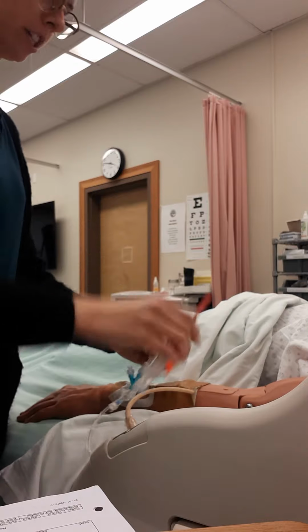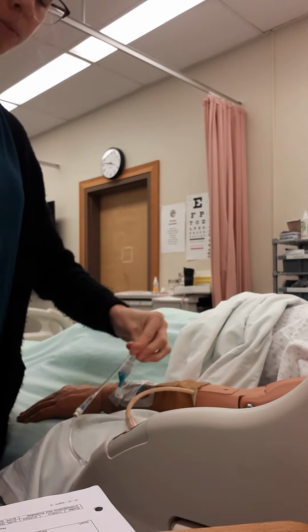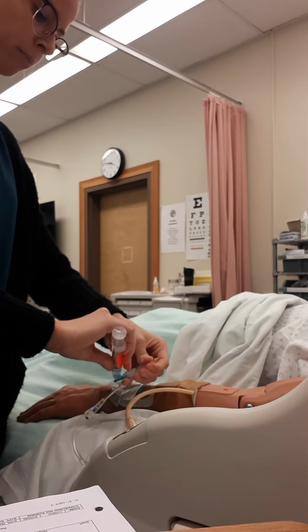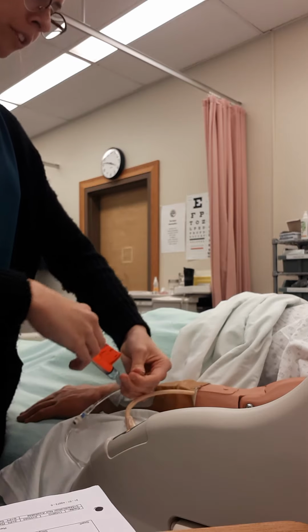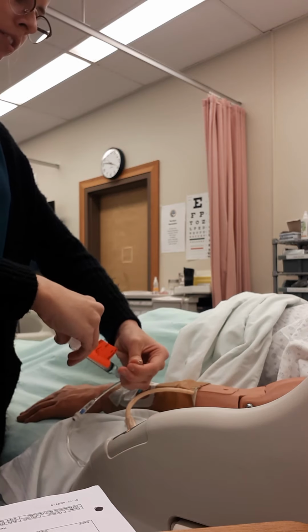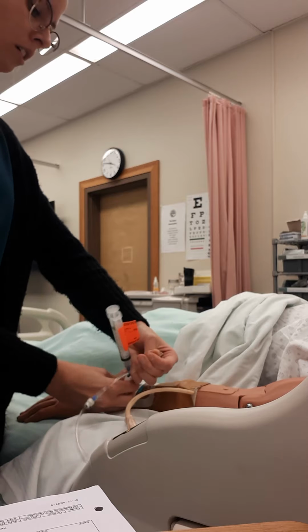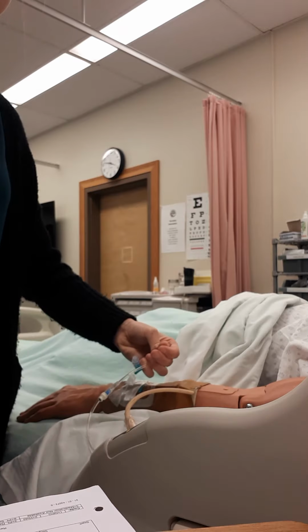I'm going to have my medication. I'm going to take the cap off. And put that cap in the sharps. And over 30 seconds, I'm going to unclamp here at her site, and I'm going to infuse it. There we go. Clamp that. So I've given her medication.